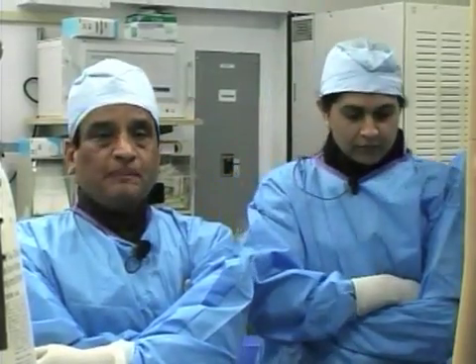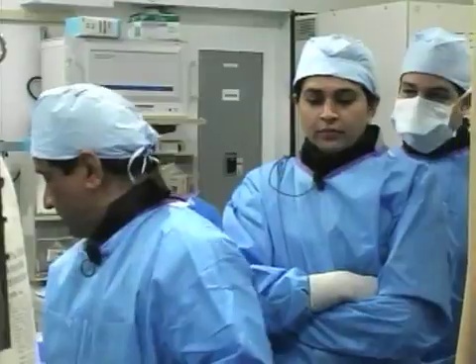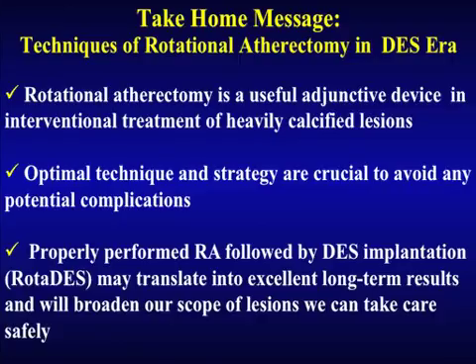Anu, excellent case demonstration, stepwise use of the Rotablator, wonderful techniques, increasing your margin of safety. What would be your summarizing points today? Yes, take home message, Samin. Therefore, if we can just get back to our last slide, rotational atherectomy is a useful adjunct device in interventional treatment of heavily calcified lesions, like this kind of case.